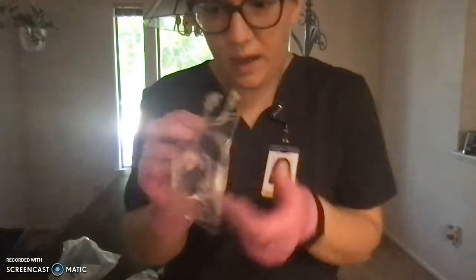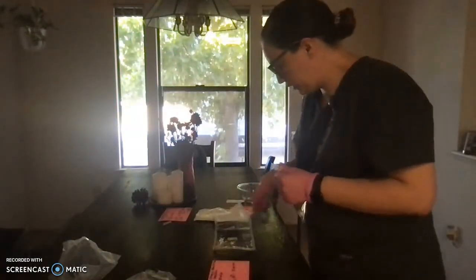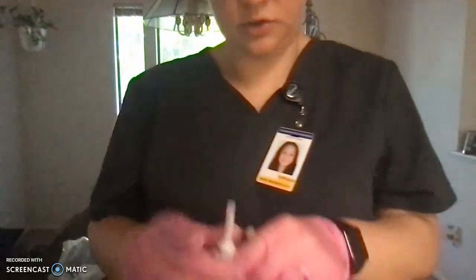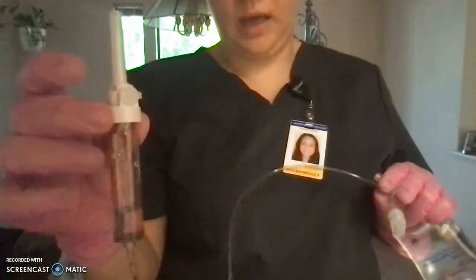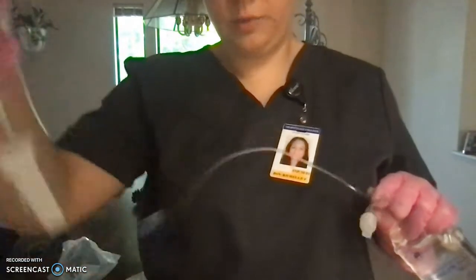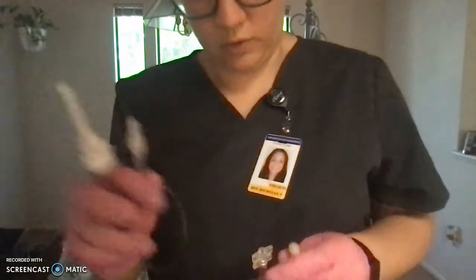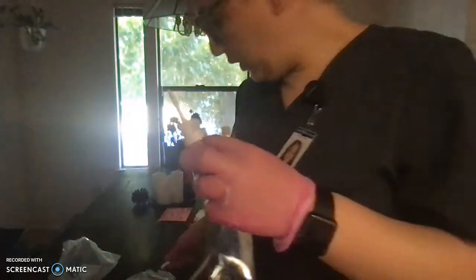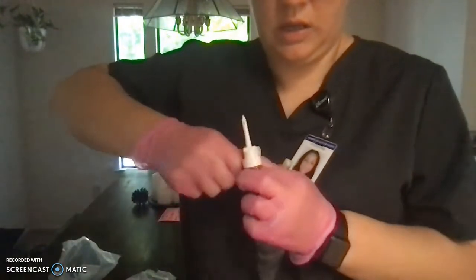So this is your piggyback, and this is your secondary tubing. Once again, it has a spike, a drip chamber, tubing, a roller clamp, and an adapter as well. That'll go on the Y site.